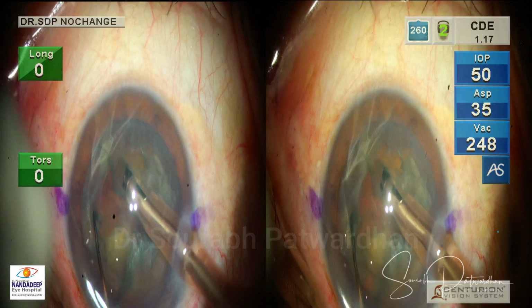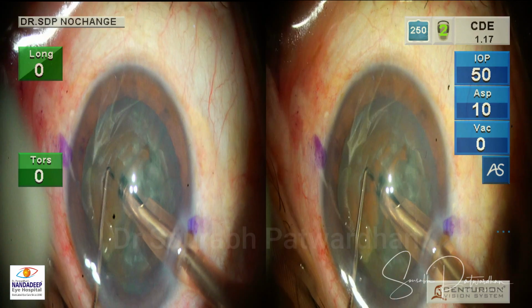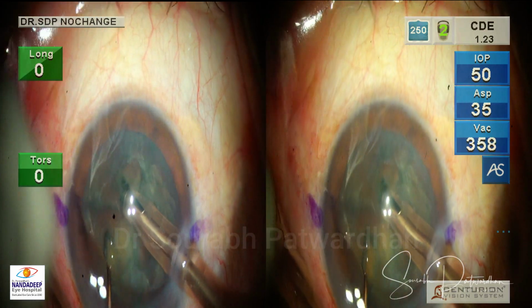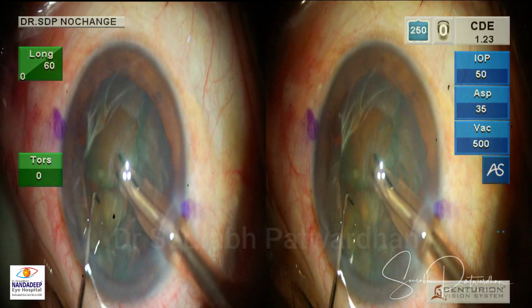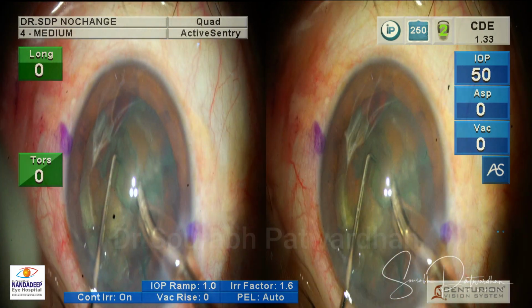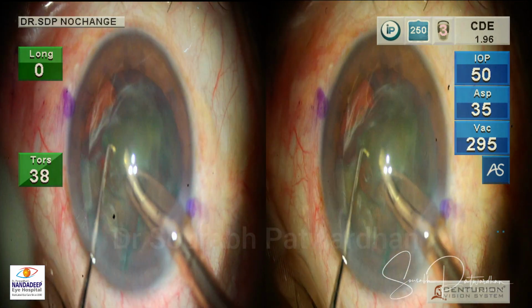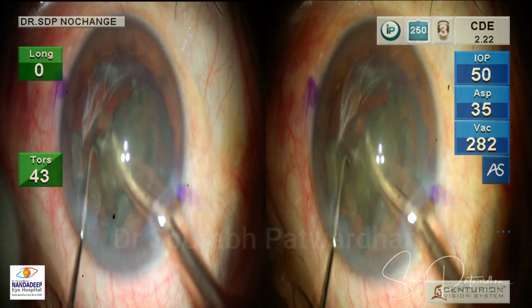So it's just choppable. If it was even softer than that, I might have preferred a trench divide technique. So the first piece, this one I want to take it out. So I have divided it into 4 pieces only because it's a soft cataract.